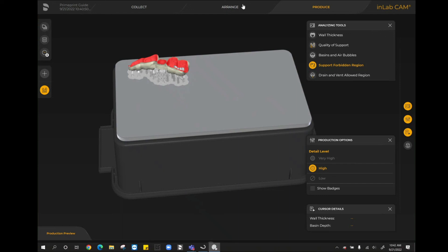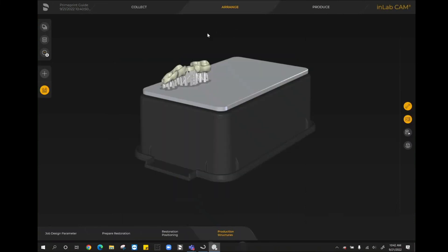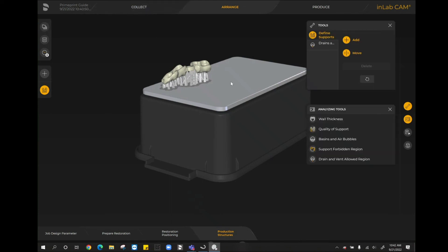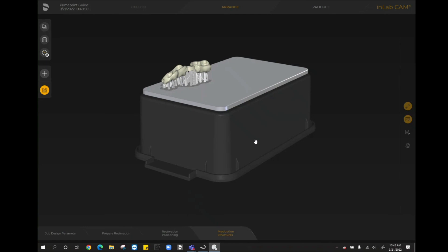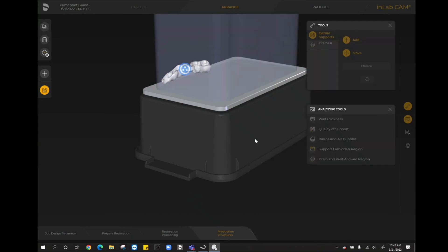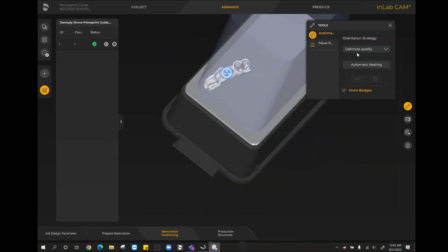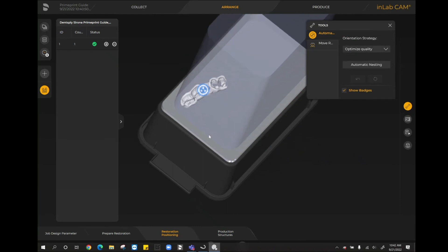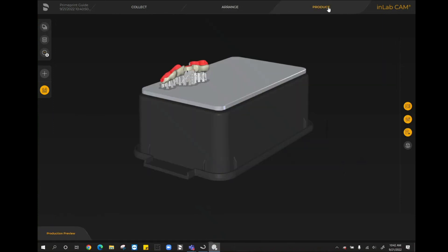If we did want to go back into the arrange stage and maybe add an additional case, we absolutely could. Or if we wanted to print multiple guides, we can go back to the collect stage, add the additional guides that we need. Or here in the arrange stage, we are able to go to restoration positioning to reposition this. However, I would recommend to always go with the optimum printing when it comes to printing a guide. Optimizing quality, because we do not want to compromise any of the quality of this for the sake of the print.